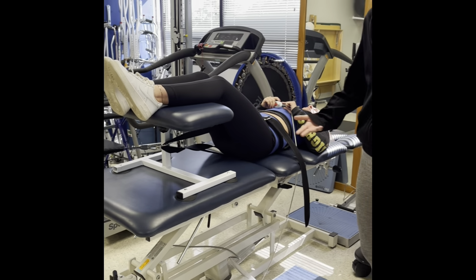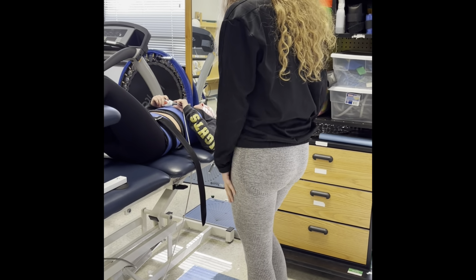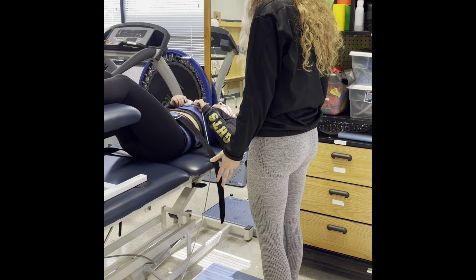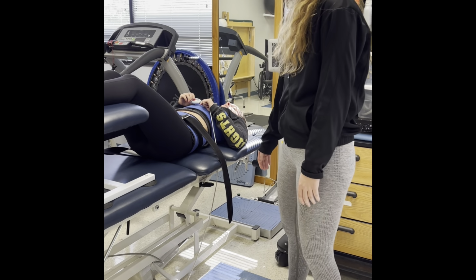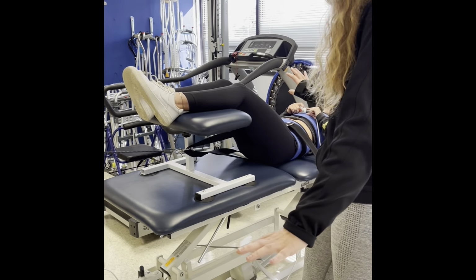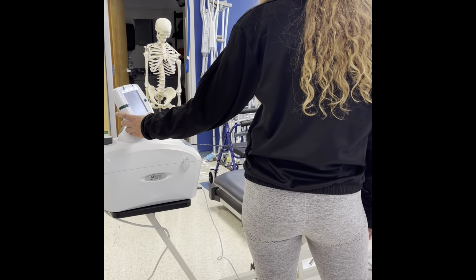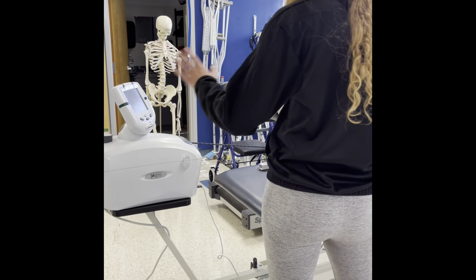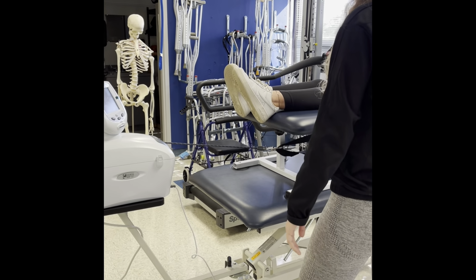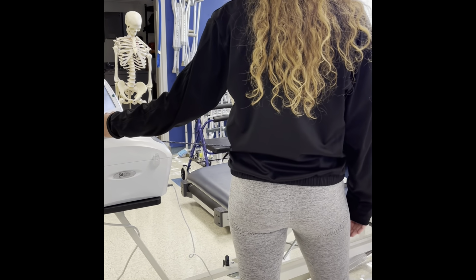Okay, now we would be doing this for 10 minutes, so I would come back in 5 minutes, check how you're doing, see if it feels okay. Then, let's pretend that it's completely done. I'm going to go ahead and press stop, and you have to wait for it to pull back down. Do you still feel it?